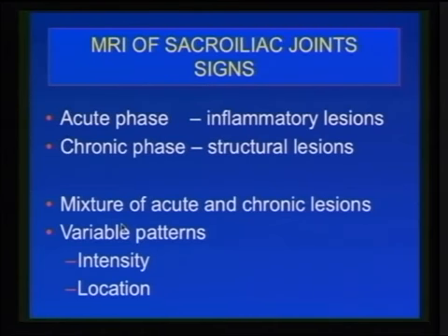So now, if we do MRI, Dr. Asif Saifuddin just now spoke about the inflammatory stage of Modic classification type 1, which is really important in here. If you see edema, that means it's fluid. STIR is a fluid-sensitive sequence. It will be bright signal intensity. The fluid on T1 weighted will be low signal intensity. So if you see any changes which are high signal intensity on STIR, low signal intensity on T1, this is an acute inflammatory stage.